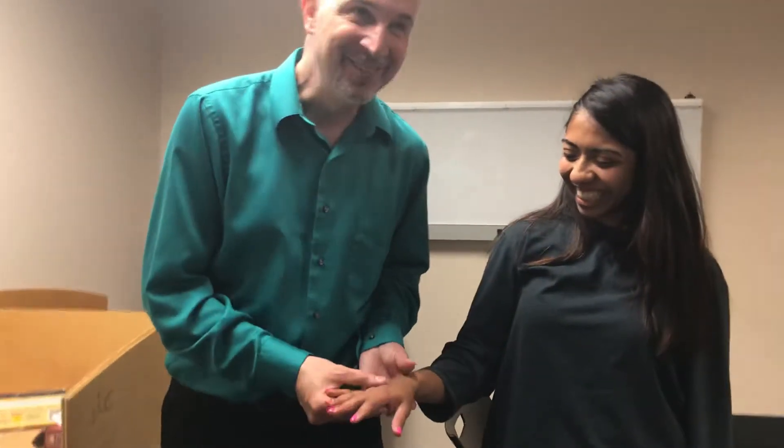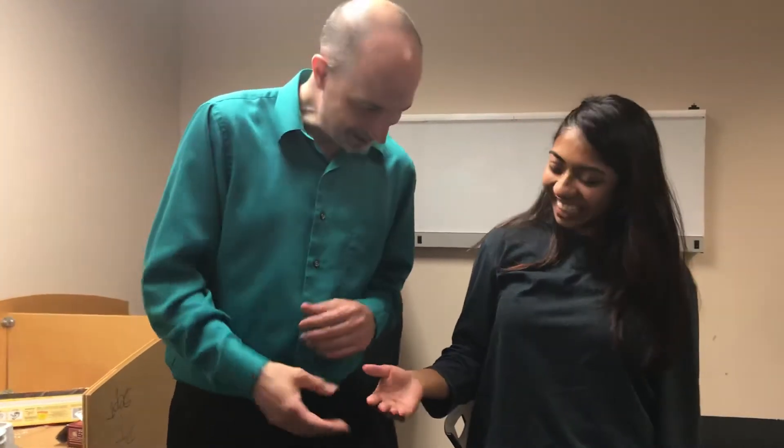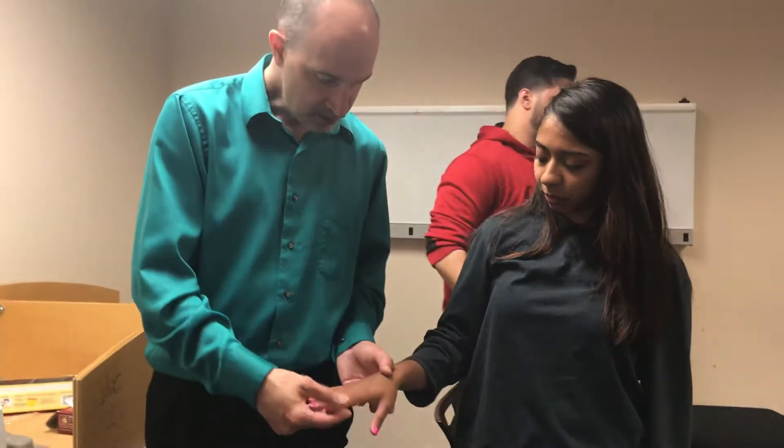Okay, hello, we're talking about paraffin now. We both have already washed our hands — excellent job — and that would be with soap and water and not with Purell, that wouldn't work.